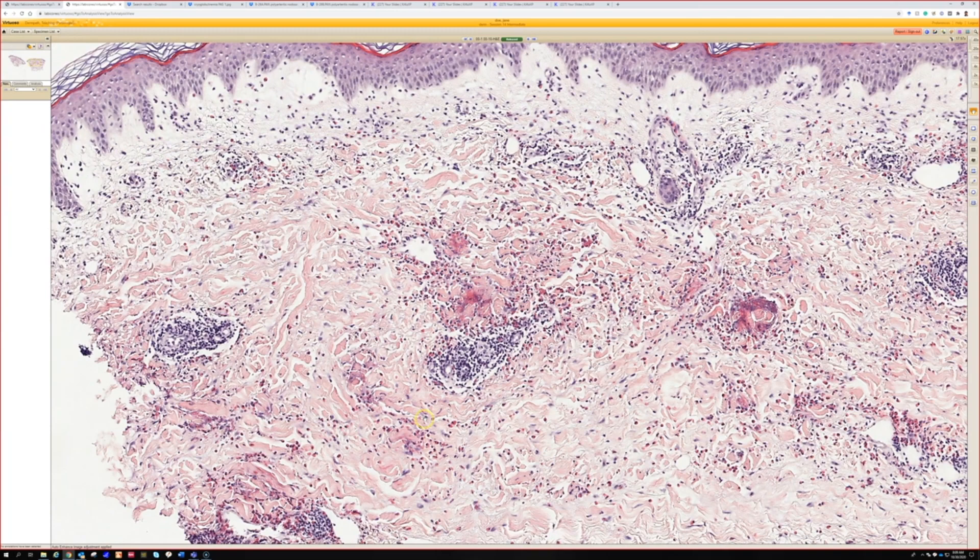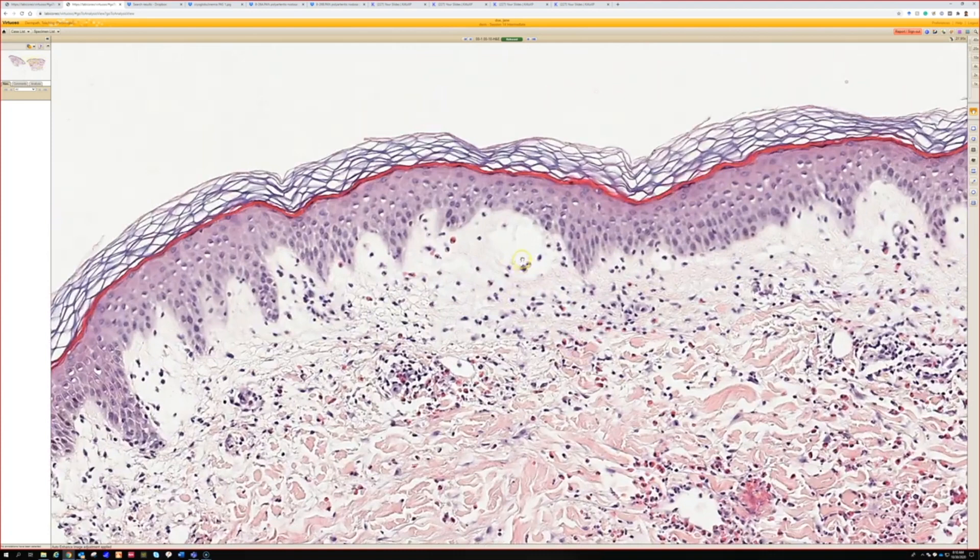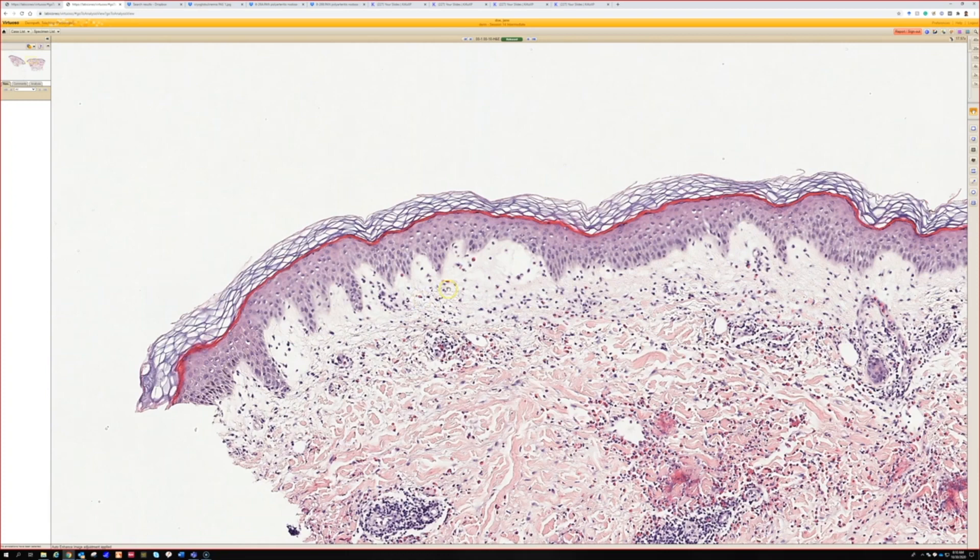Anytime you see a ton of eosinophils, start looking to see if you can find some flame figures. There are also some lymphocytes around the vessels, and the dermis is very edematous. Look at how pale that papillary dermis is — the papillary dermis is beginning to almost fall apart and kind of lift up, making almost an edema-type blister overlying it.